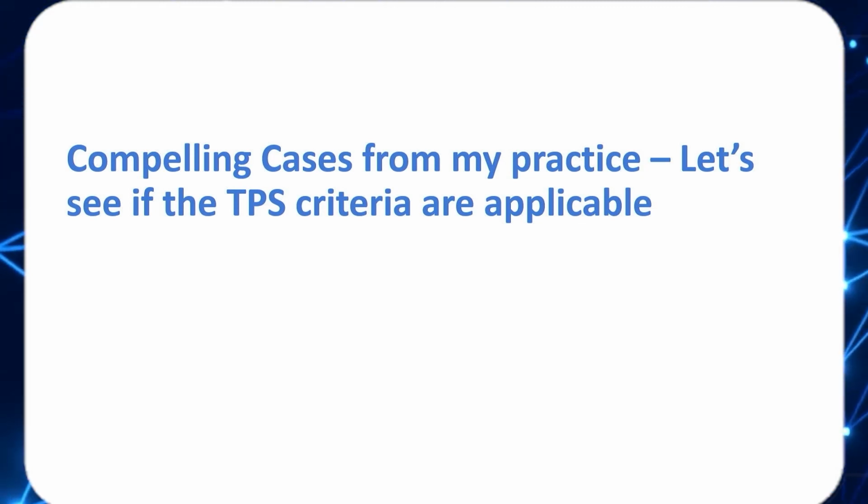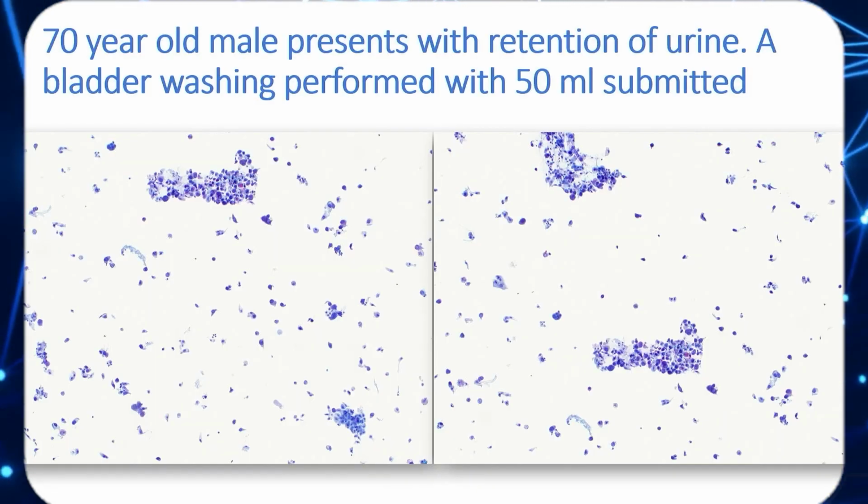So we have a few minutes and let's have some fun here. I mean, probably not so much fun for some of these patients, but certainly as practitioners and as individuals who sometimes have to figure out these difficult puzzles that fall in our practice, sometimes on a daily basis. So this is the first case.